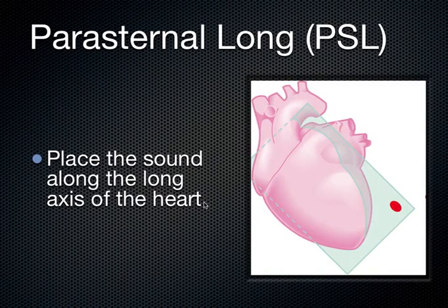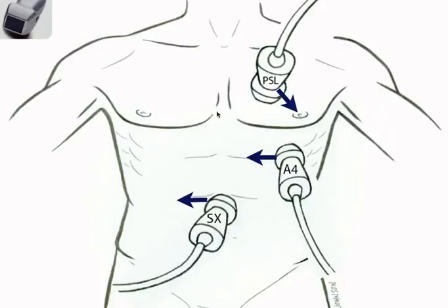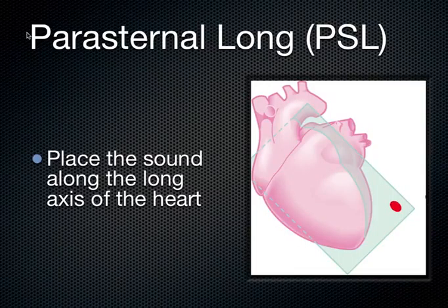To go through these in a little more detail, the parasternal long axis, as its name suggests, parasternal, you've got the probe right next to the sternum. So if the sternum is right here, you've got the probe. I actually put the probe on the sternum and then just slide it off a little bit, aiming the indicator toward the patient's left if I'm doing the parasternal long. And this is what the transducer looks like that we use. It's the P21 or phased array, small footprint, 21 millimeters of footprint there right along the parasternal region.